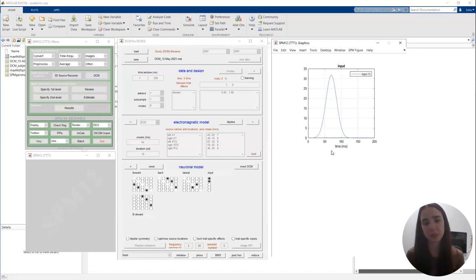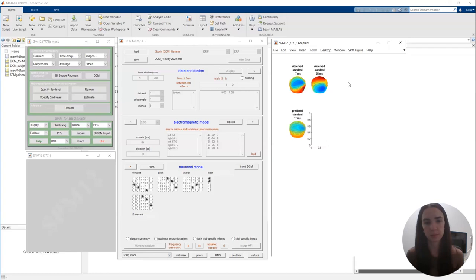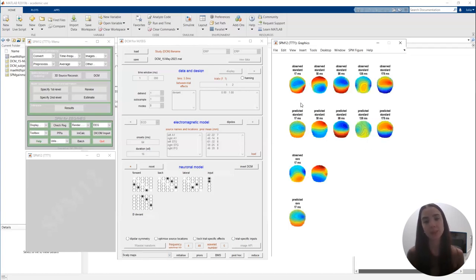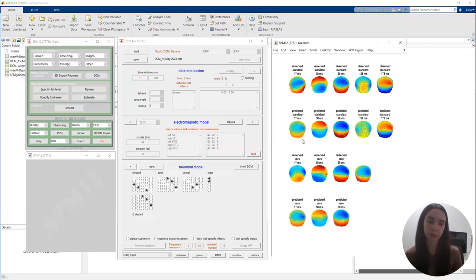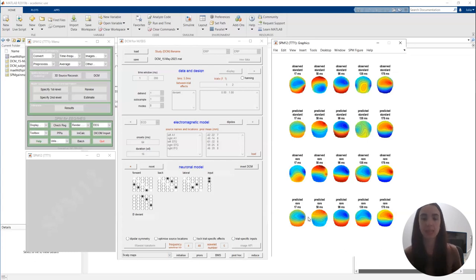We can also see our input, where the prior onset was at 64 milliseconds (the default) with a duration of 16 milliseconds. Finally, we have the scalp maps, which are also a very good way to tell if we're fitting our data. We have observed and predicted responses, with the first two rows being the standards and the next two rows being the deviants — though this will depend on your specific design.